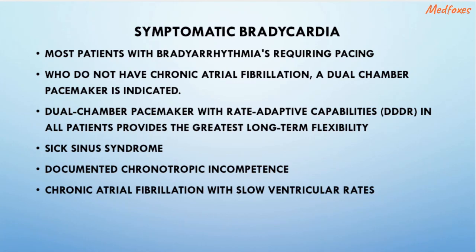For most patients with bradyarrhythmias requiring pacing who do not have chronic atrial fibrillation, a dual chamber pacemaker is indicated. Using a dual chamber pacemaker with rate adaptive capability in all patients provides long term flexibility. In some situations, however, rate adaptive pacing is essential, including dual chamber devices placed specifically for patients with sick sinus syndrome and fatigue from documented chronotropic incompetence, and patients with chronic atrial fibrillation with slow ventricular rate.